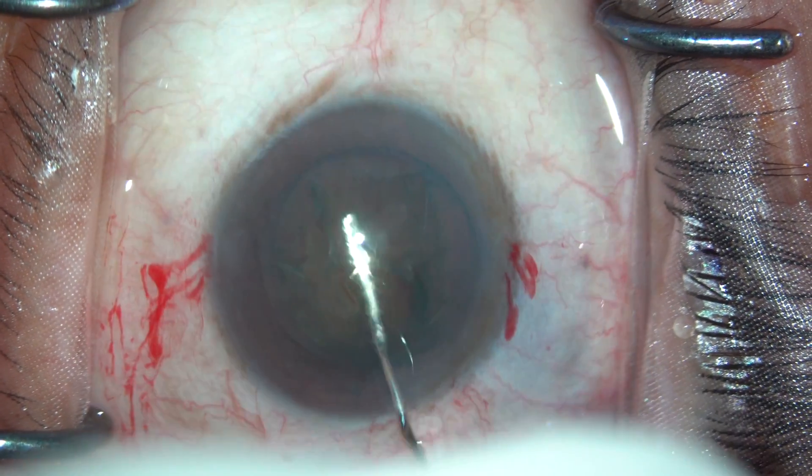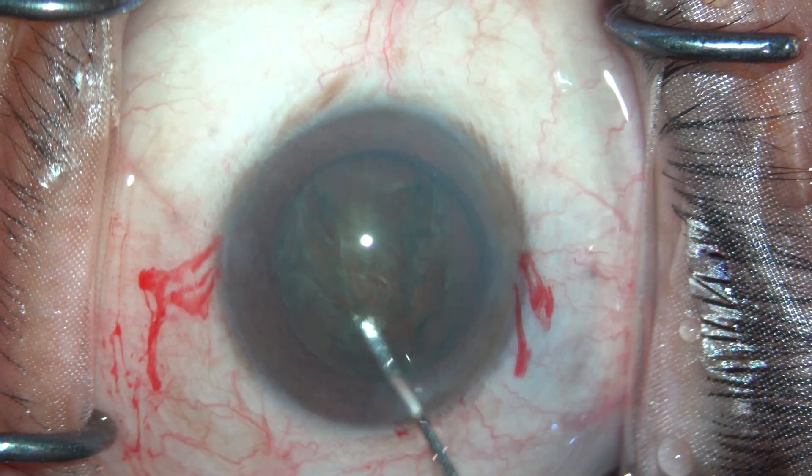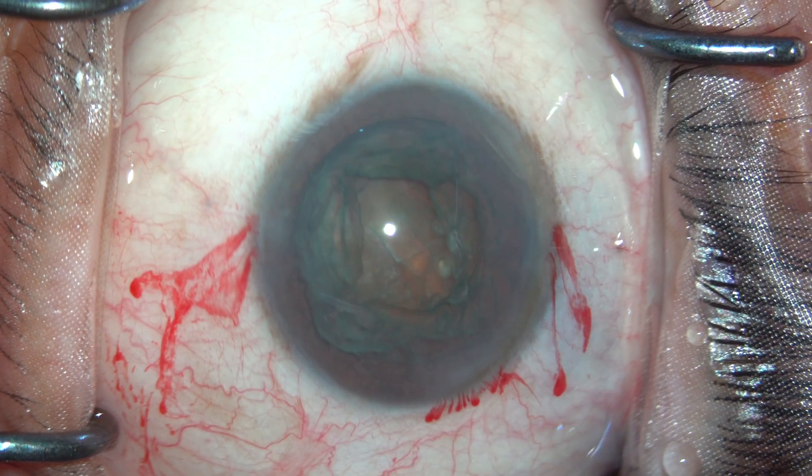This is then followed by hydrodissection and little tapping movements. The nucleus is rotated and some OVD is put again inside the anterior chamber.